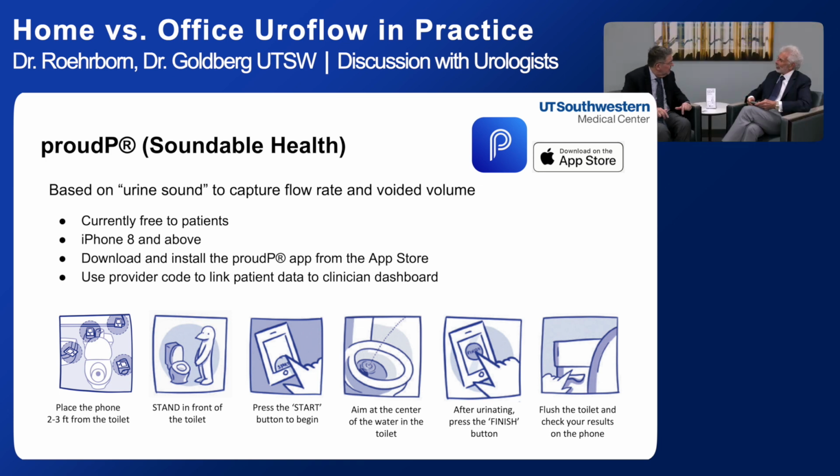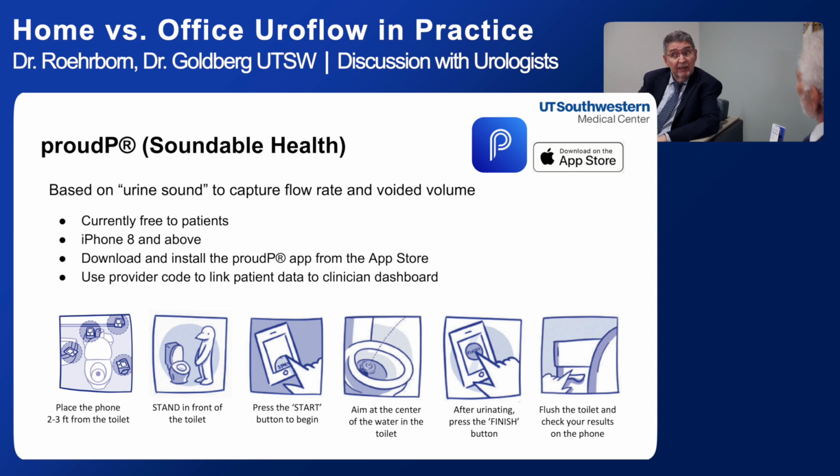Let's just play this through. This is different from the office, right? In the office, we tell the patient, we need you to do a flow rate. Here's the flow rate meter. Go there, pee in that machine, and it better come out good. That's right. And now we're at home.